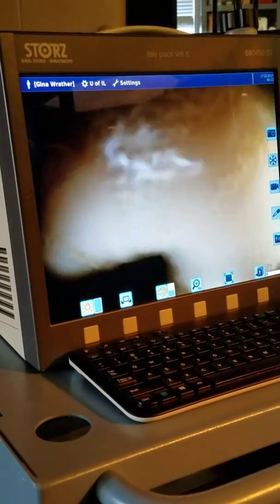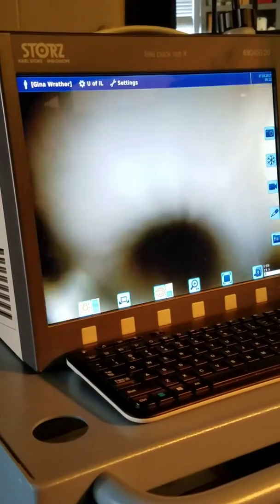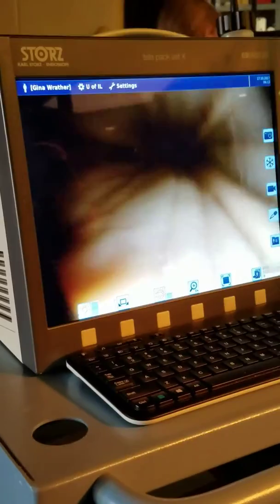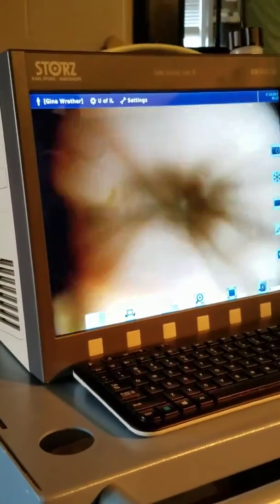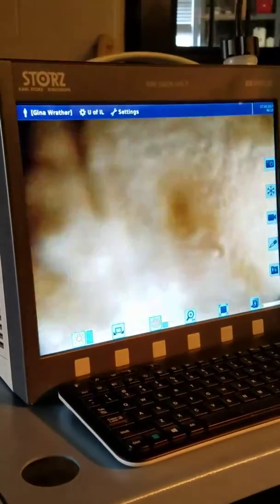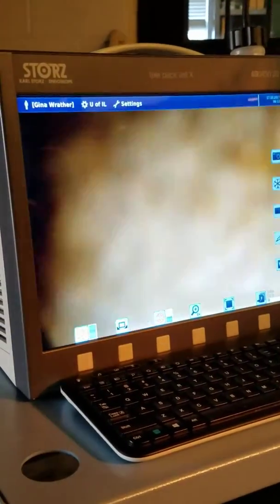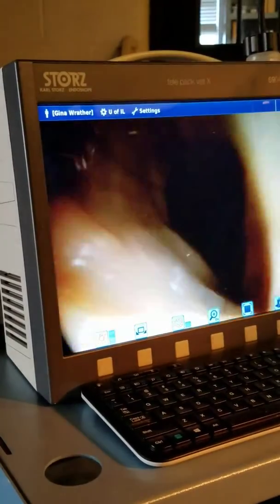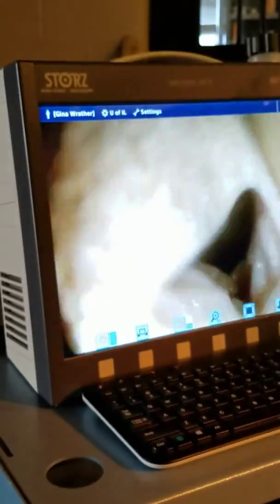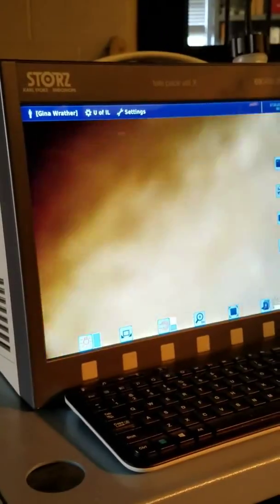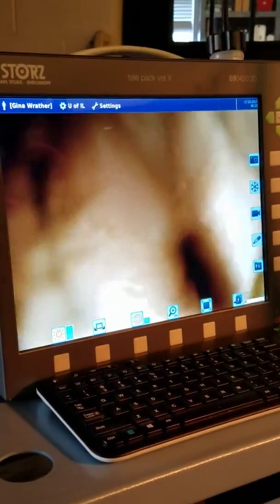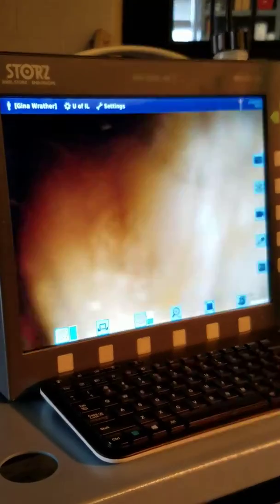So now he swallowed us into the esophagus here, so we're just going to keep going. As long as it feels smooth, we can keep going. We'll look at his esophagus a little bit better on the way out — it sort of collapses on you on the way in.